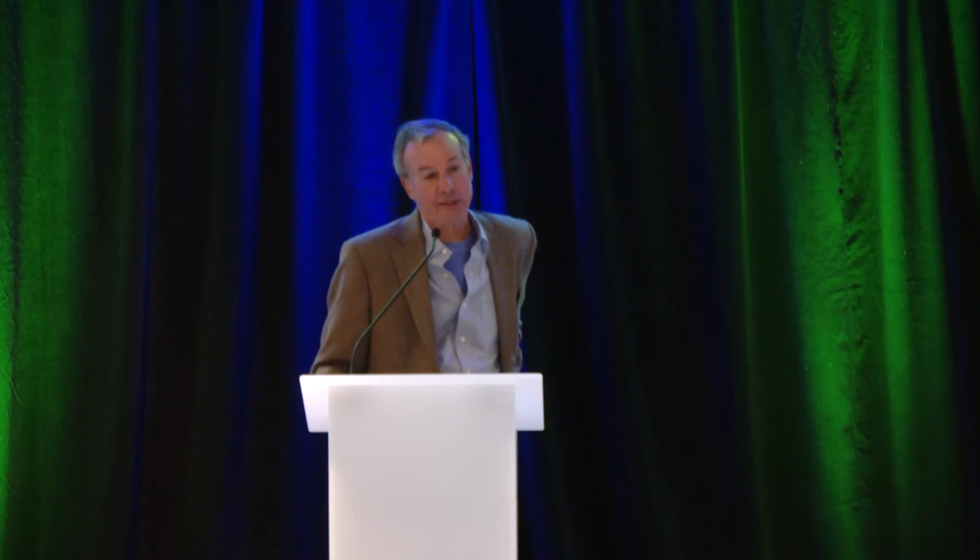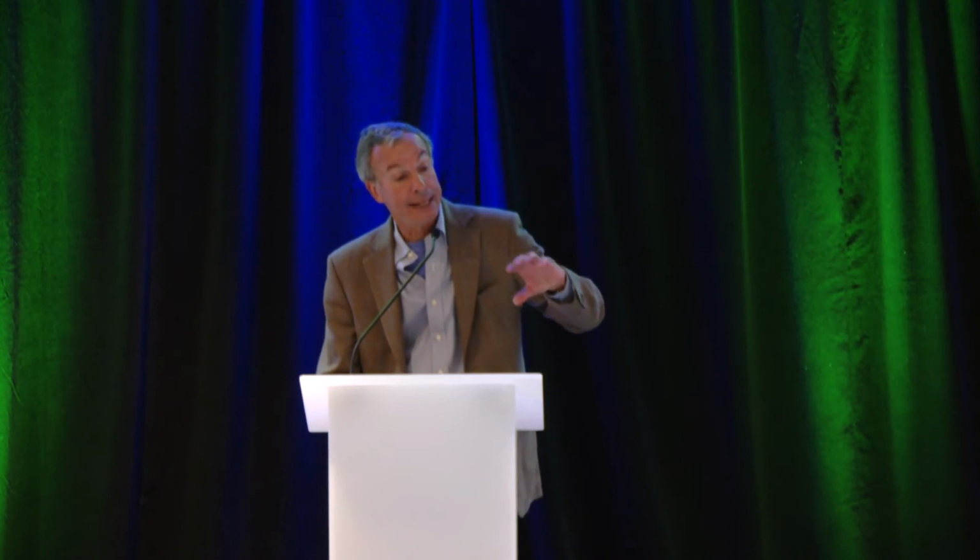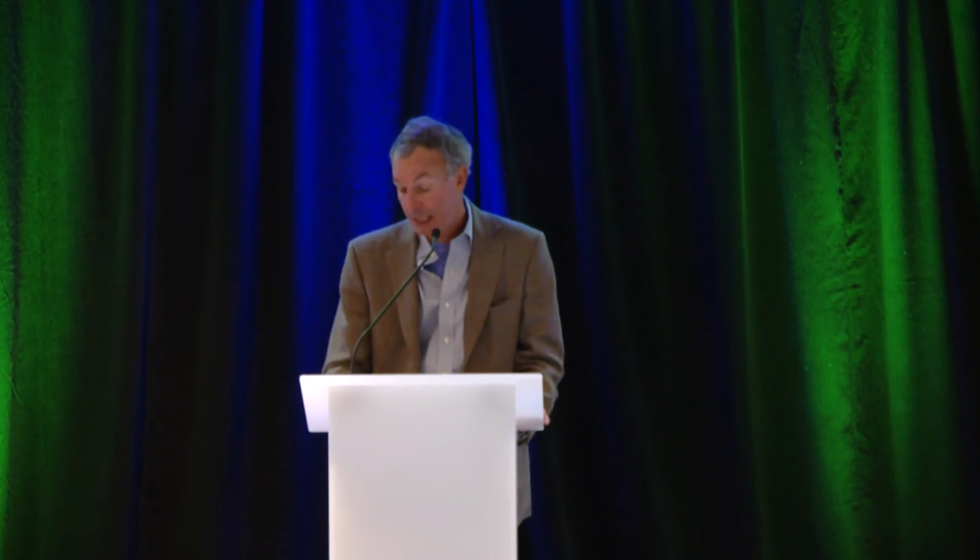And this is the chain of high-resolution manometry: Sierra, Given, Covidien, Medtronic, and now it's Medtronic, of course. So you'll recognize the 36 sensor device there, and maybe you won't recognize the one that was called high definition for a while, where you actually now have not only closely spaced sensors, but they preserve the circumferential pressure signature as well. So this is illustrative of that. This is a 3D HRM assembly, so you have your typical HRM sensor at the top there, where it does detect pressure in 12 different sectors, but it just averages them. Whereas the sensors there, the high definition ones, detect pressures in 8 sectors and preserve them.